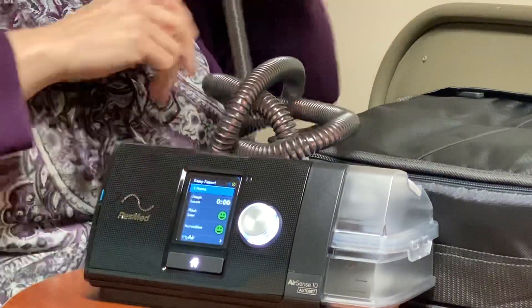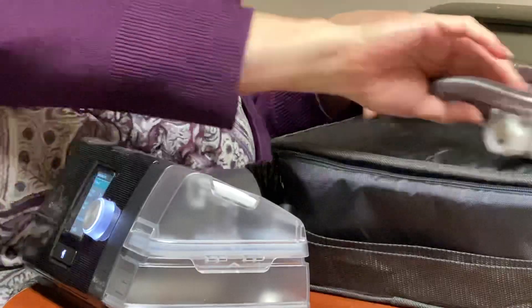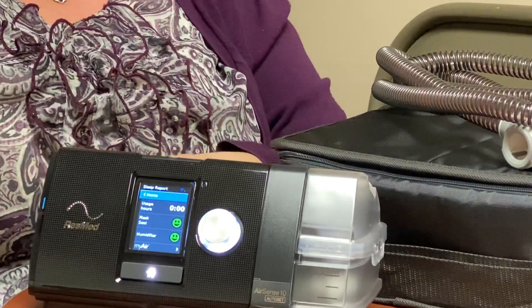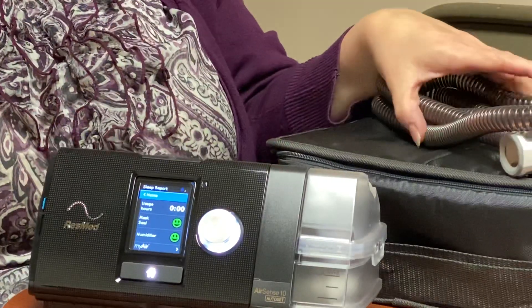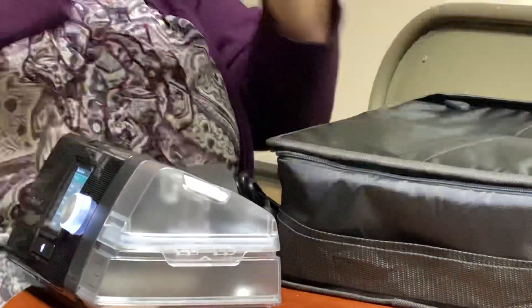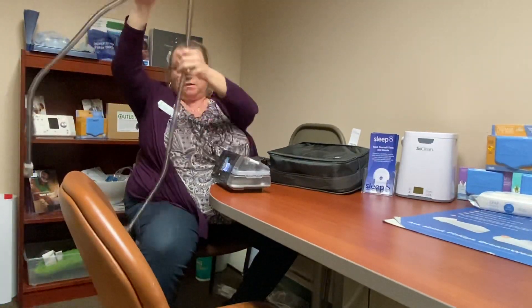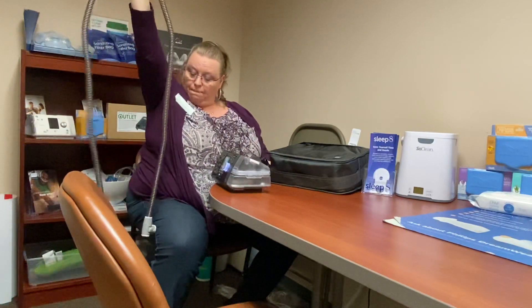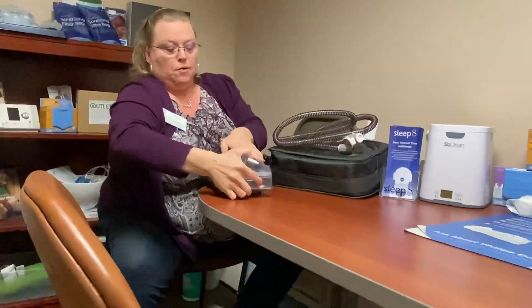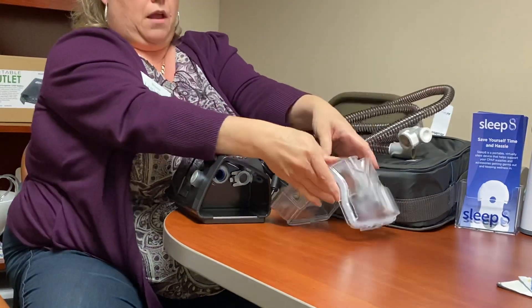Now every CPAP machine — when you come get our stuff for curbside, we will send you home with a bunch of papers, and in there will be one very important one: how to keep your CPAP machine clean. Every morning you're going to want to unhook your tubing from the back and hang it up to dry. You do not have to unhook your mask, but you do need to wipe it off every morning and hang that to dry. Then take out your water chamber, open that up, dump out all the water, and leave that to dry.